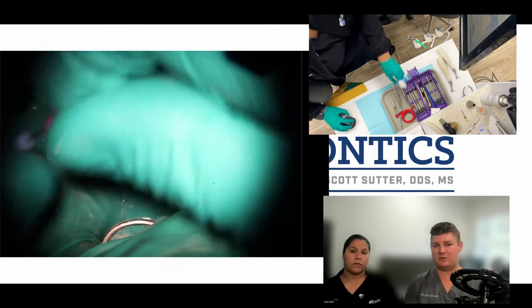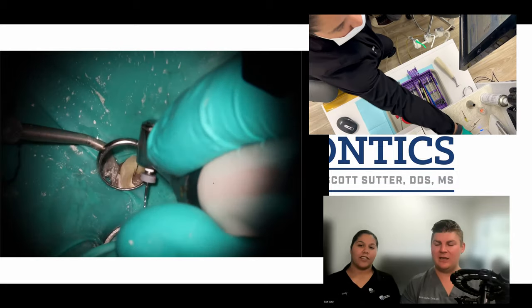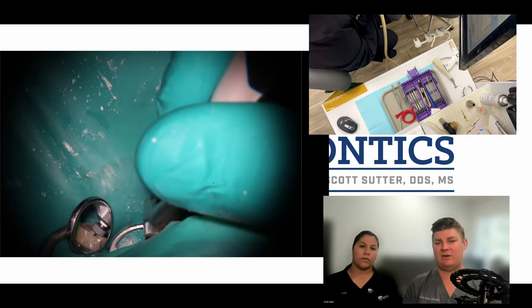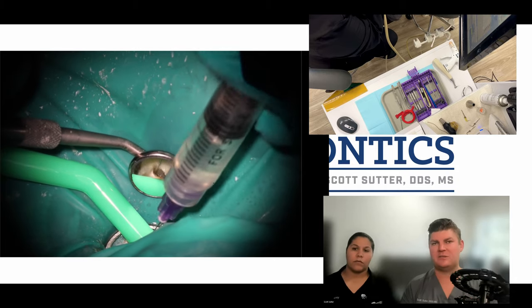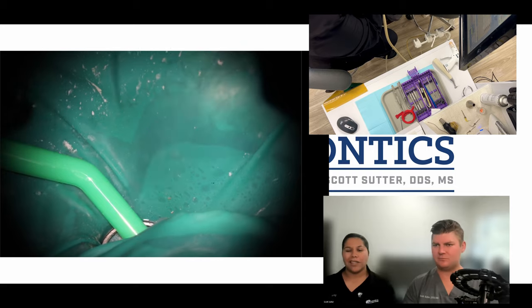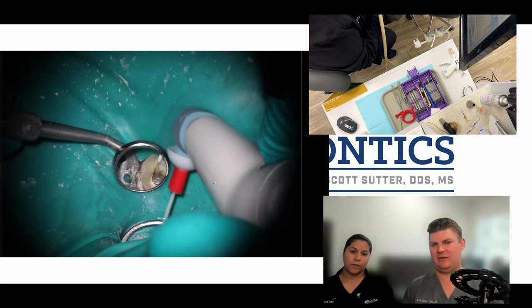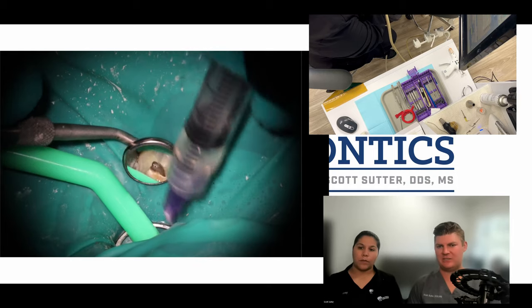We got our fourth and final one looking good for the MB2. I was happy with where we got with the 2006 — we're just going to finish this to the 1704. I got within about two millimeters of working length with the 2006, so not really any point taking it all the way; take the 17 down just to make sure we have a nice glide path for the squirt technique. At this point we're doing the final rinse — the big rinse to make sure we get all debris out before we obturate the case. She's grabbed the EndoActivator and I've grabbed the beta and turned it on.